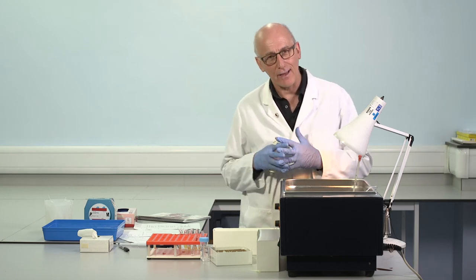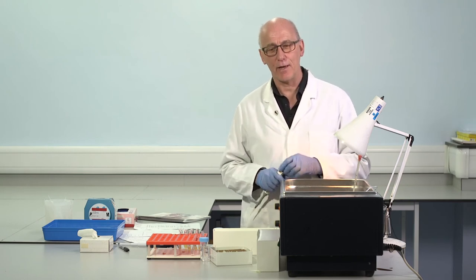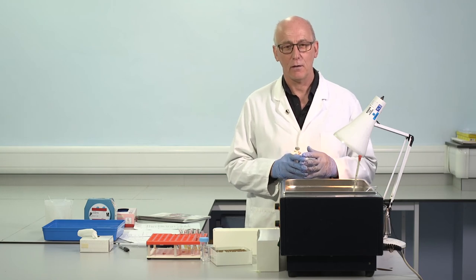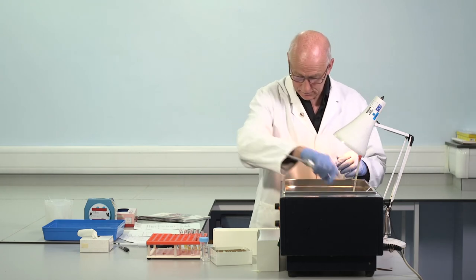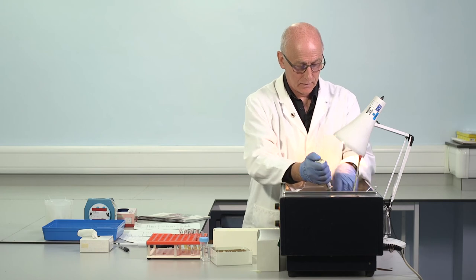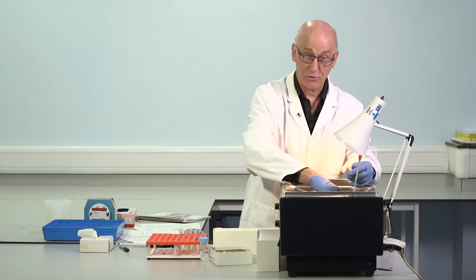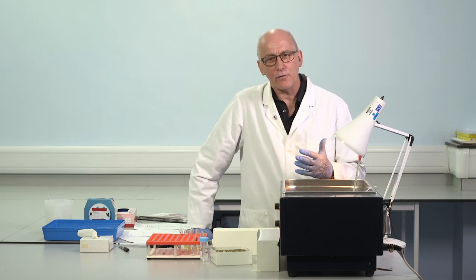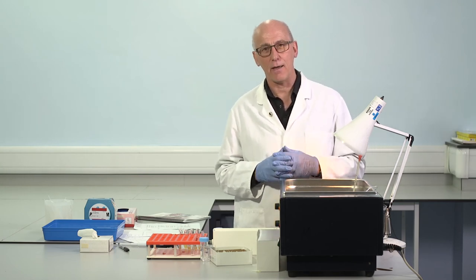So what happens is the degree of prolongation may differ. Whether or not the result is normal or abnormal also differs between patients depending on the reagent. And in particular, the phospholipid concentration is a major determinant of whether or not there will be a prolonged time when we make an APTT. And there are some very big differences between the concentration of phospholipids in different APTT reagents. Very big differences. About a 20-fold higher concentration in some reagents than in others. 20 times higher in some. And if the concentration is very much higher, this reagent will usually be very much less sensitive to, less affected by lupus anticoagulants.